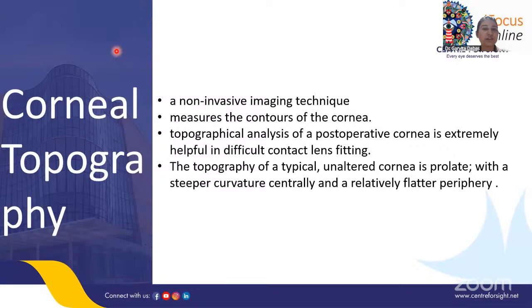So, what is corneal topography? As we've already discussed in the previous classes, just to revise it, it is a non-invasive imaging technique that measures the contour of the cornea, and it is very important for our contact lens fitting, because the topographical analysis of this post-operative cornea helps us to find the base curve of the contact lens that is to be fitted. Further, the topography of a normal, typical, untouched cornea is prolate, as we've already discussed previously, which implies that it is steeper in the center and flatter in the periphery.